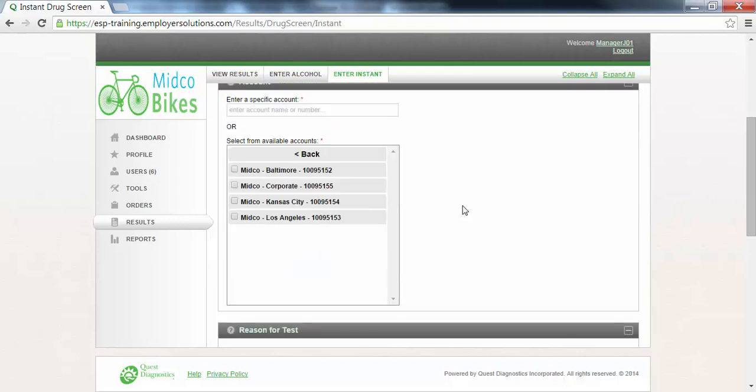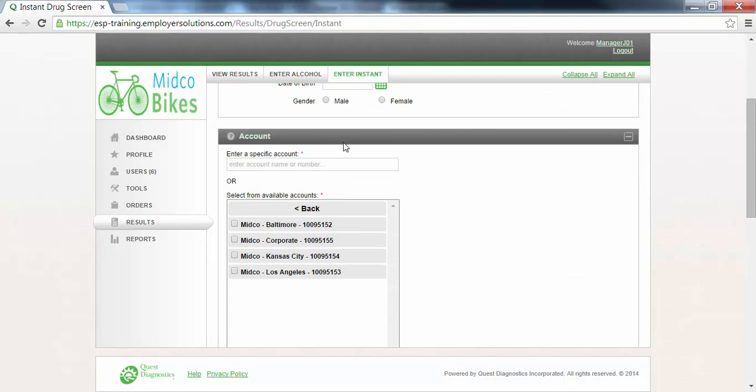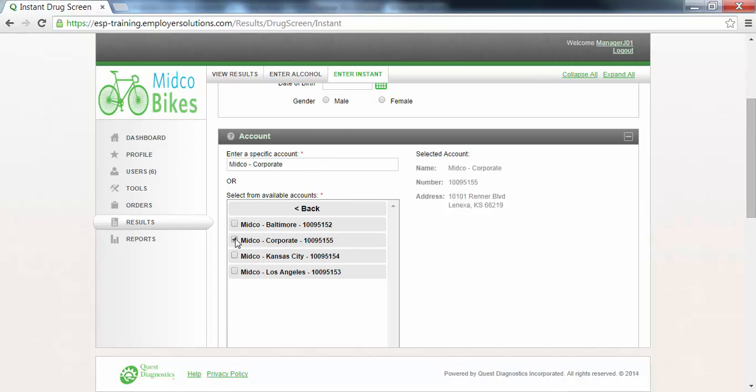The account section will display a list of all of the Quest Diagnostics accounts available to you. Only one account may be selected. Select the checkbox next to an account in the available accounts list. In this example we will select the account for the corporate location.